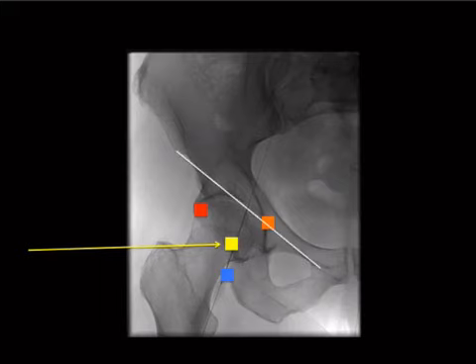Now, you want to be aware of this thing, which is the inguinal ligament, which runs from the anterior superior iliac spine down to the pubic tubercle. So you always want to stick below that. Sticking above that is what people call a high stick, and it makes you susceptible for a retroperitoneal bleed because you can't compress the vessel over the femoral head, which is what you're trying to do. So the ideal spot is a puncture mid-femoral head, which is around 1 to 2 centimeters below. So right there, something like that.